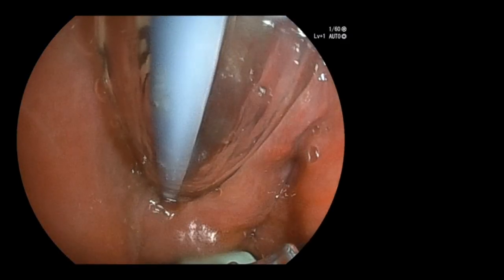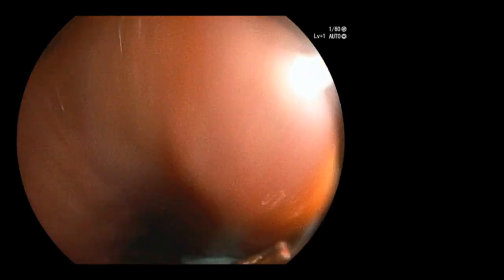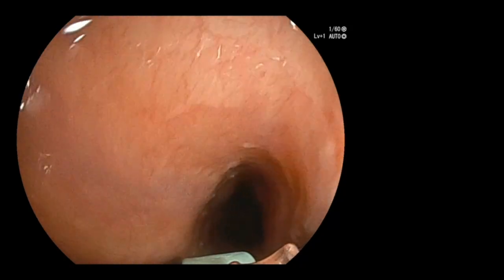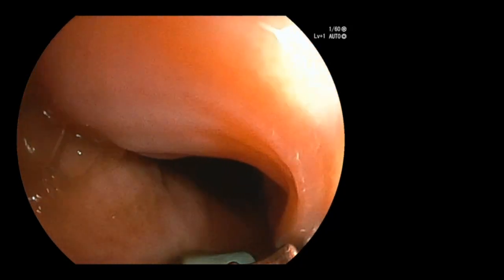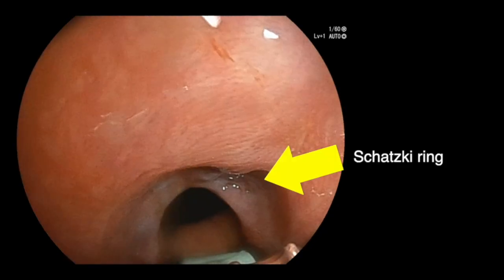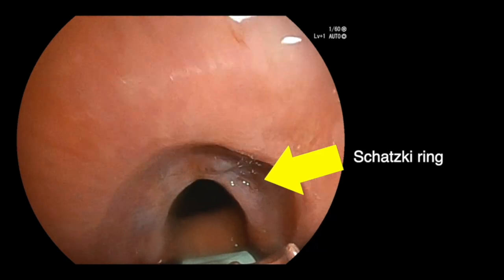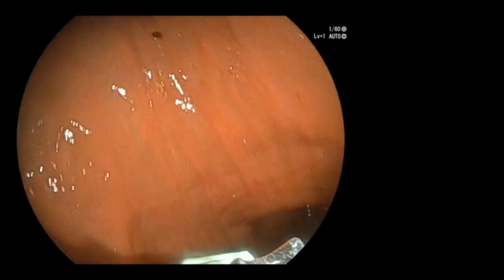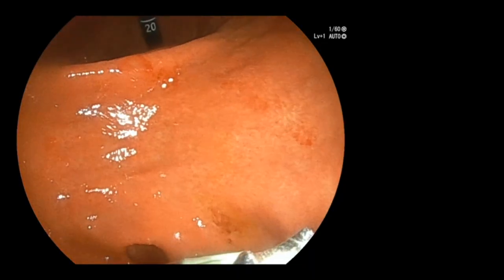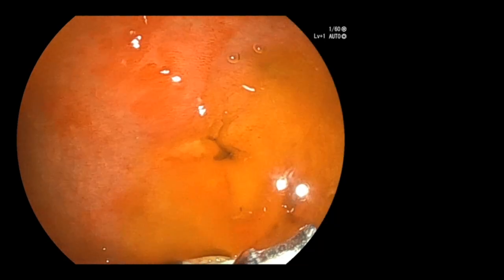A 66-year-old patient with pancreatic head cancer presented with gastric outlet obstruction secondary to duodenal stenosis. The Fujifilm EG740UT echoendoscope was advanced across the cricopharyngeus and into the esophagus, and then across the GE junction to the stomach. Note the excellent endoscopic view at intubation, which otherwise is not possible with standard linear array echoendoscopes. This degree of endoscopic vision will preclude inadvertent tear or perforation in patients with large cervical osteophytes or luminal cancer.